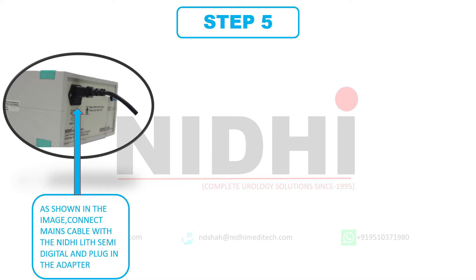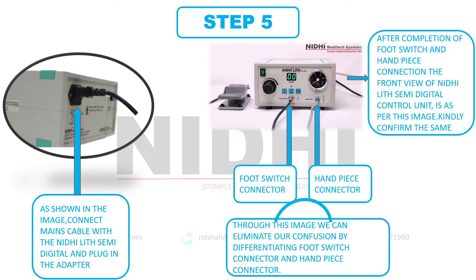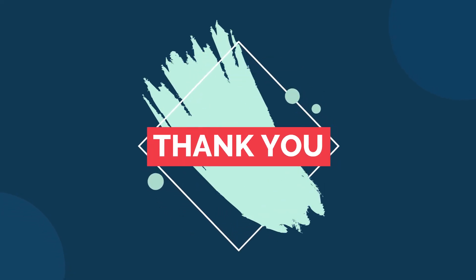This is the last and final step of our installation process. Now again we need to go to the back side of the Nidilith Semi-Digital control unit. As we can see in the image, just connect the mains cable with the Nidilith Semi-Digital control unit and plug in the adapter. This image is the front view of the Nidilith Semi-Digital control unit after the successful connection of footswitch and handpiece. If you have any confusion between the footswitch connector and handpiece connector, here we are differentiating both. We have now completed the entire installation process of the Nidilith Semi-Digital control unit. Thank you so much for watching this.